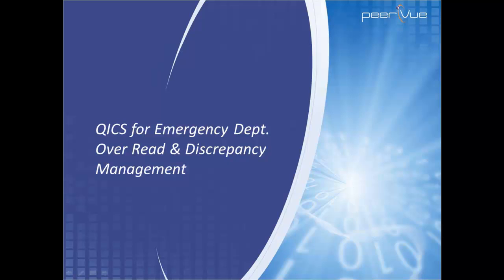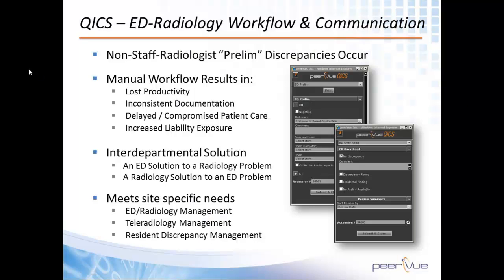QICS for Emergency Department Overread and Discrepancy Management. When it comes to interdepartmental communications, many sites suffer. Most evident in radiology is the communication between the ED and radiology.